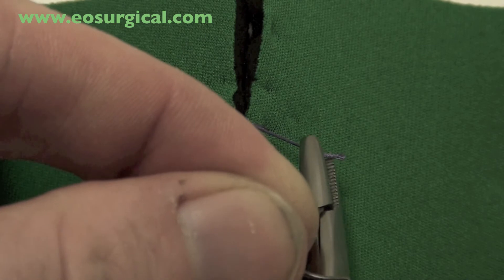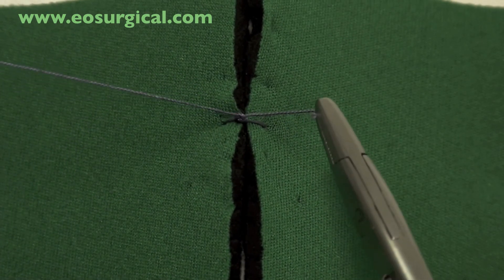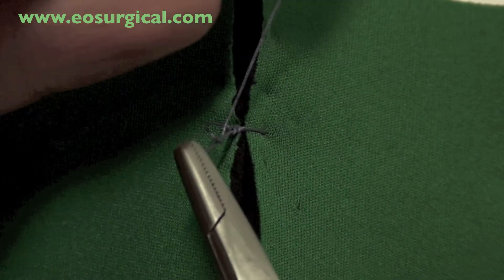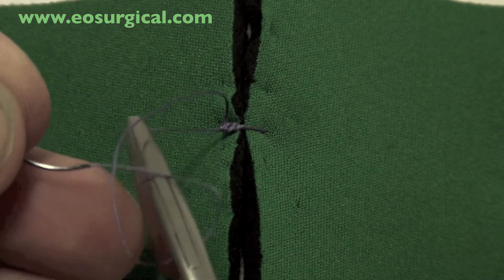Here's it again, closer up. Note how each time the hands move backwards and forwards to ensure a flat knot is thrown.